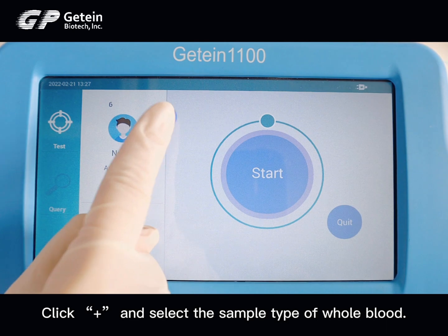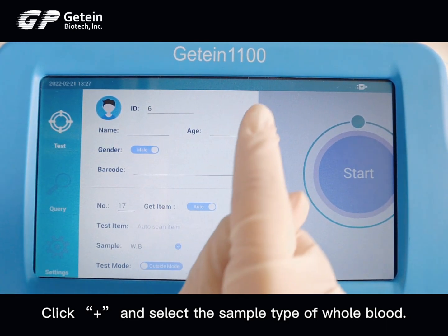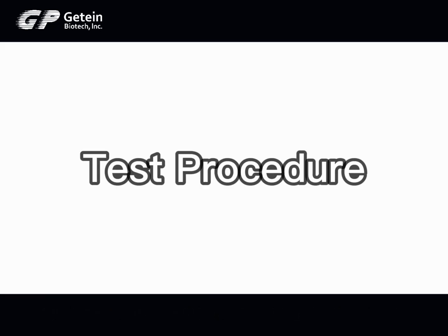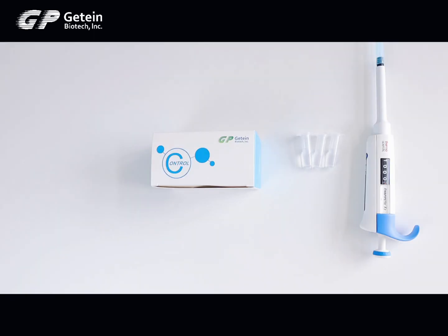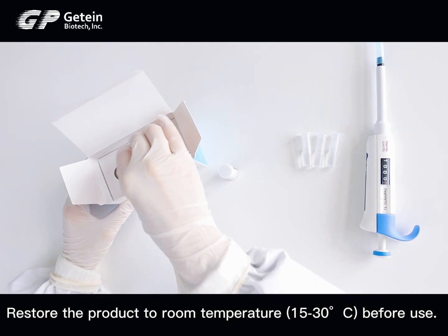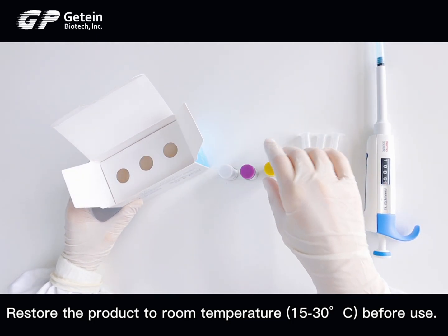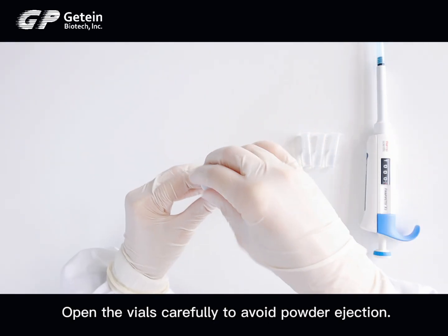Click plus and select the sample type of whole blood to begin the test procedure. Restore the control to room temperature, from 15 to 30 degrees centigrade, before use.